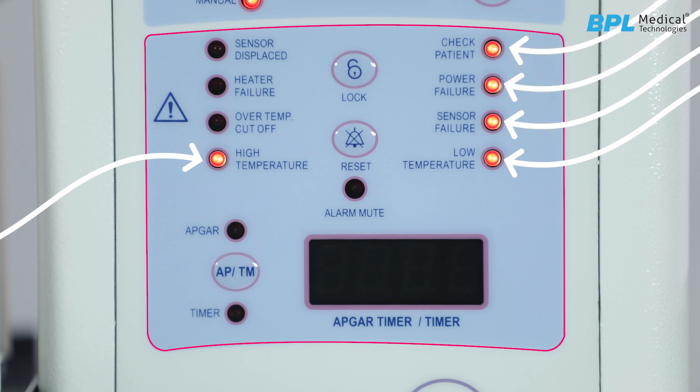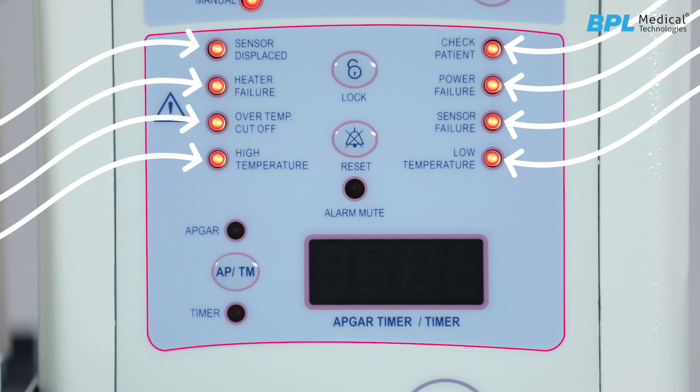The baby warmer contains various alarms: low temperature, high temperature, sensor failure, power failure, check patient, over-temperature cutoff, heater failure, sensor displaced, reset, and unlock. Let us look into each alarm section.